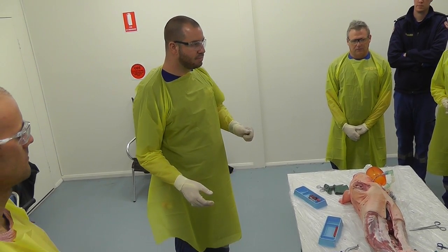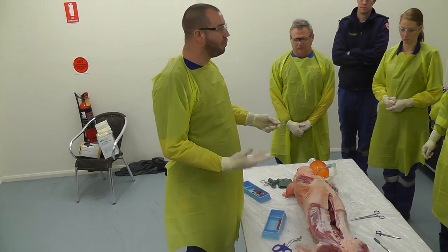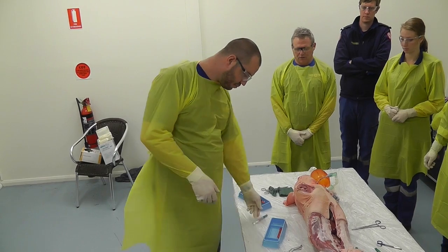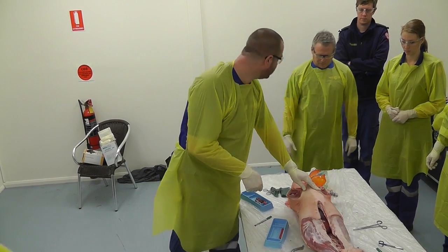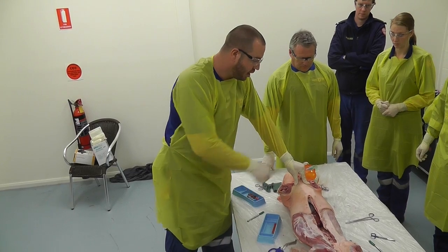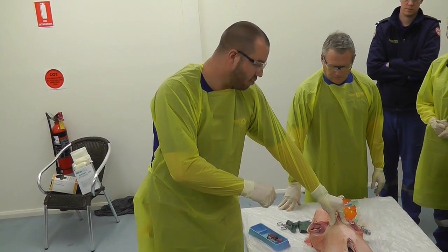You are going to reassess at that point to see whether your intervention has made a difference. Then continue the incision — a bold incision from one side to the other, joining the dots. You are going to go through the skin, the subcutaneous tissue, through into a little bit of intercostal muscle.